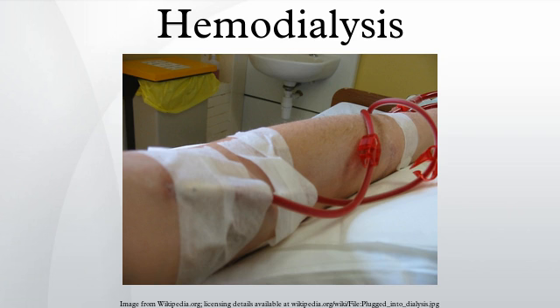Hemodialysis can be an outpatient or inpatient therapy. Routine hemodialysis is conducted in a dialysis outpatient facility, either a purpose-built room in a hospital or a dedicated, standalone clinic. Less frequently, hemodialysis is done at home. Dialysis treatments in a clinic are initiated and managed by specialized staff made up of nurses and technicians. Dialysis treatments at home can be self-initiated and managed or done jointly with the assistance of a trained helper who is usually a family member.